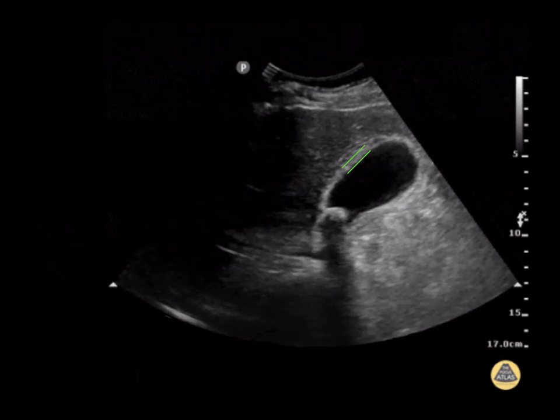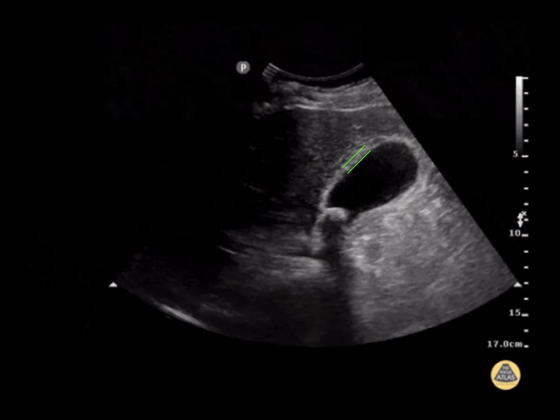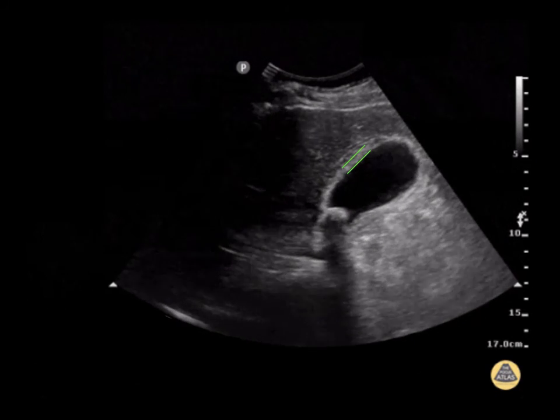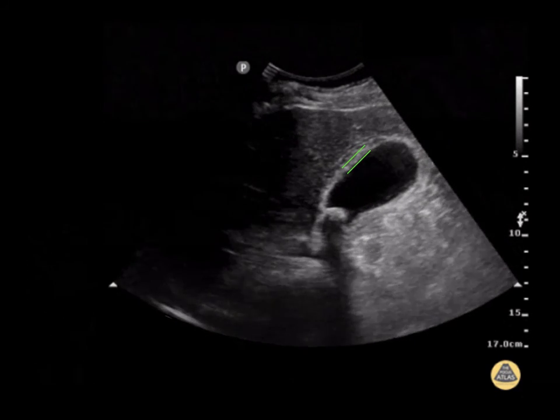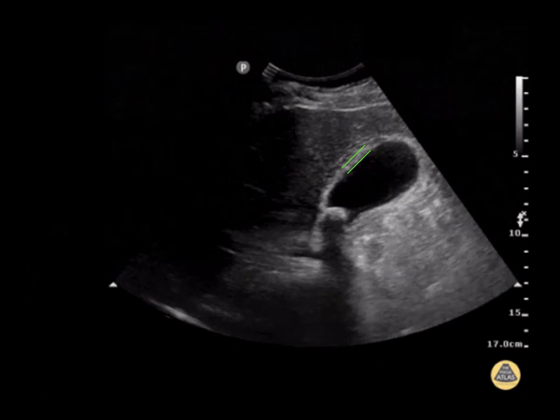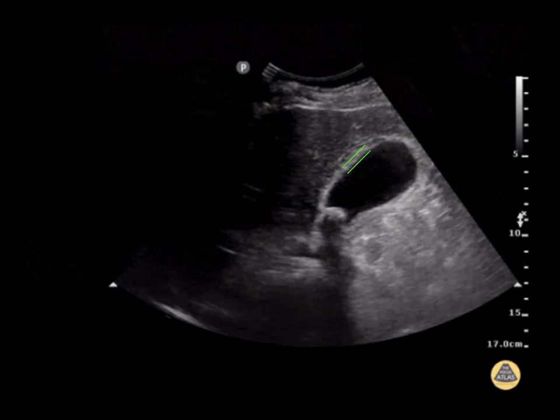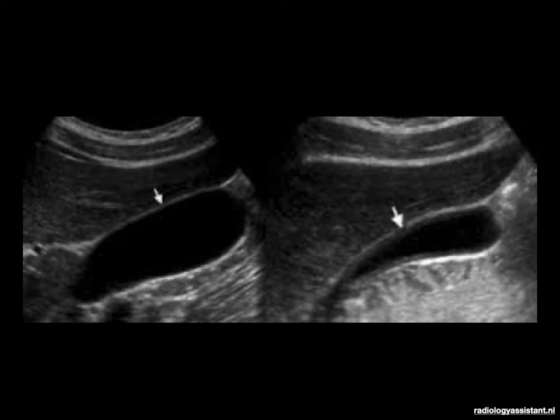Here's an example of a stone with some posterior shadowing and a thickened anterior gallbladder wall, which is at approximately 4 to 5 millimeters. Make sure that you are measuring perpendicular to the wall of the gallbladder. Here is another example of a thickened wall on the right as we compare it to a normal wall on the left.